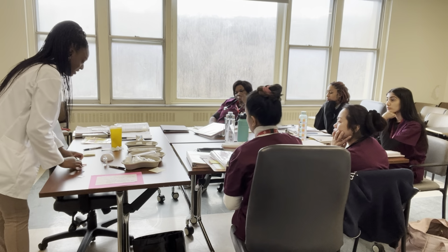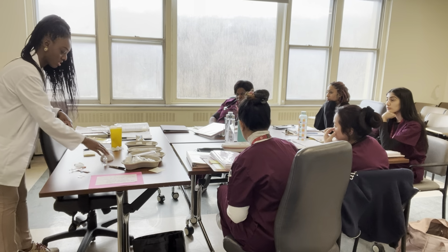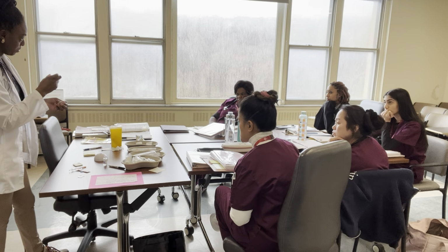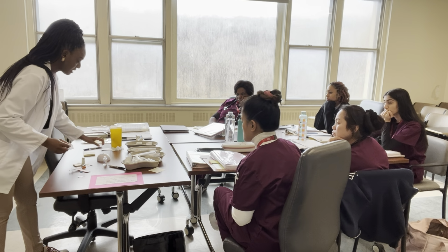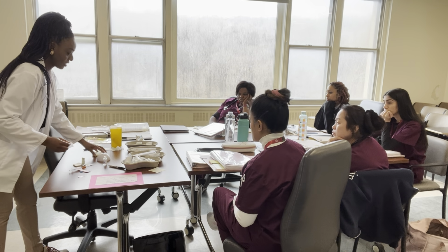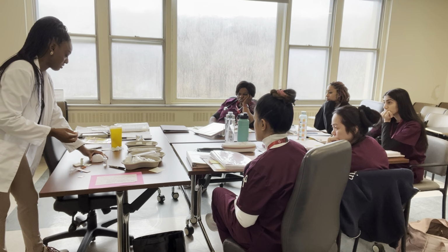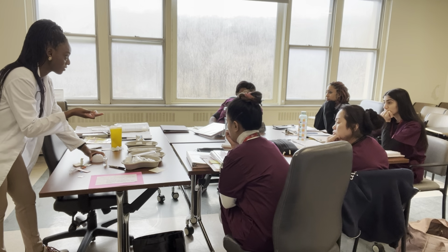Then you get all your supplies and you go into the patient's room and then you inject. In this case, we're going to inject into this patient's abdomen. The direction of the injection depends on how much fat you put between your hands. The belly button is, we'll say, here. So I go at least 2 inches away from the belly button. You clean the site. He seems to have a lot of adipose tissue, so I can go in at 90 degrees. If he had less than 1 inch, then you would go in at 45 degrees, okay?